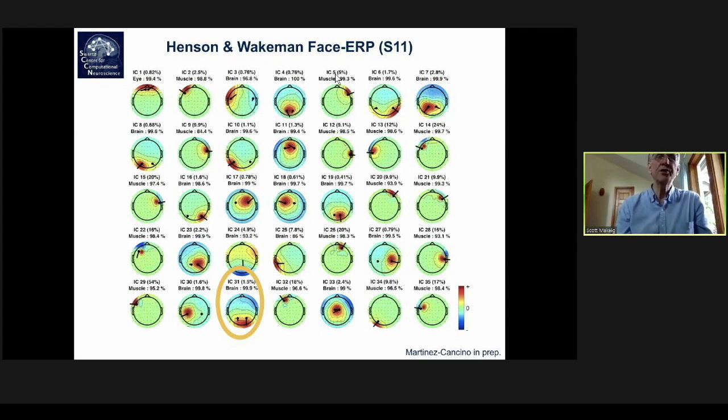So this can be looked at as pre-processing. I would look at this now as pre-processing of the data. You put it into original source space. You pay no attention unless you're doing a project on neck muscle tension and its relation to anxiety and depression. You might want to look only at the neck muscle or the head muscle component processes. But if you're interested in what's going on in the brain, then you can look at the brain processes, and need not worry that the brain processes are contaminated by muscle activity, or at least not in a major way.